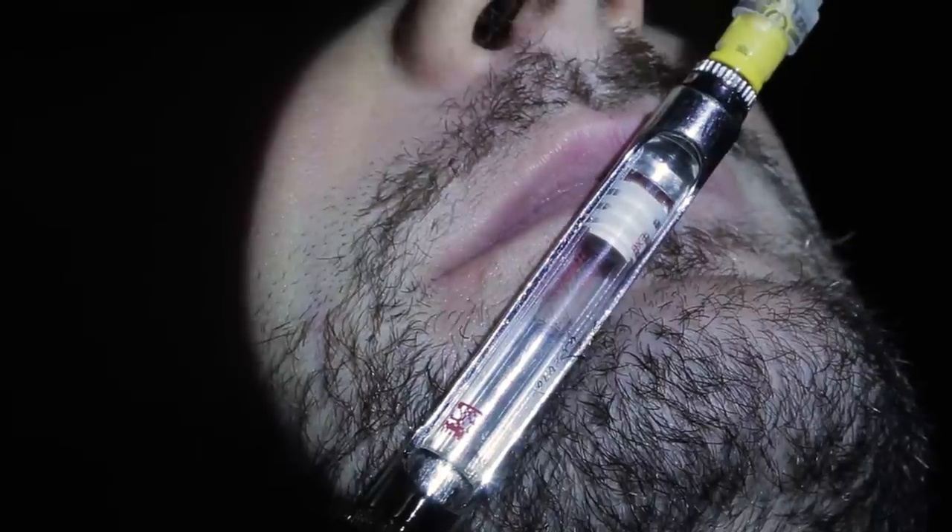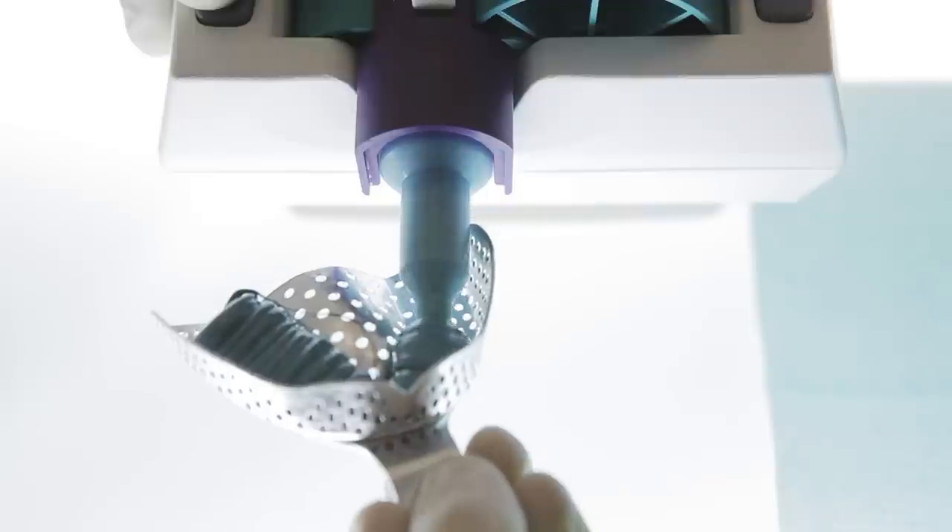Always do profound anesthesia for impressions because there is no hypersalivation. For the maxilla, I use anesthesia between the upper premolar roots because I can numb the whole front of the maxilla. For the mandible, I usually use either a double spix injection or a double mental block.